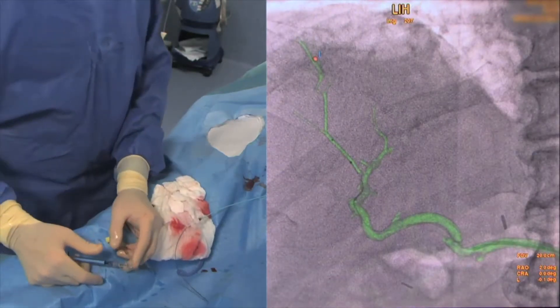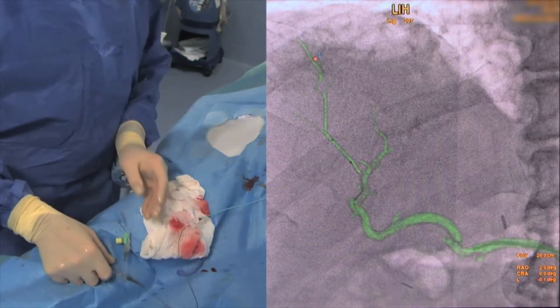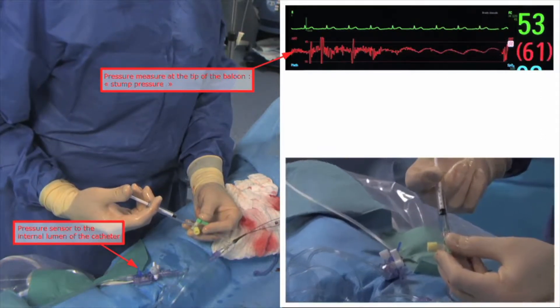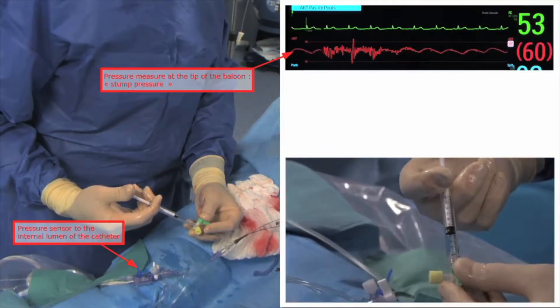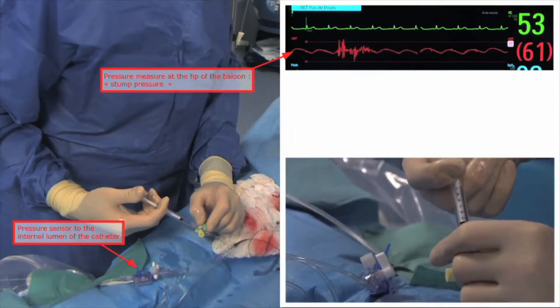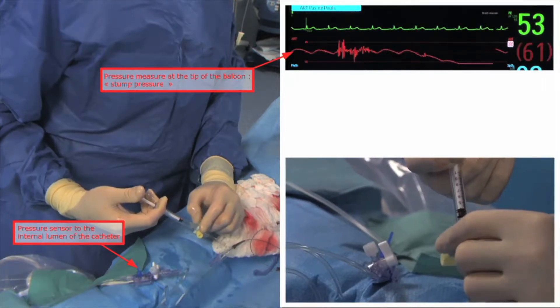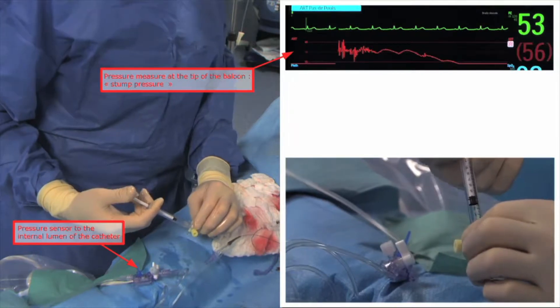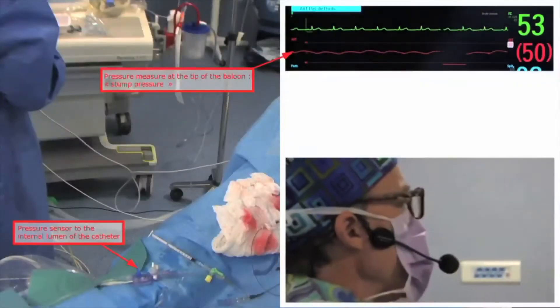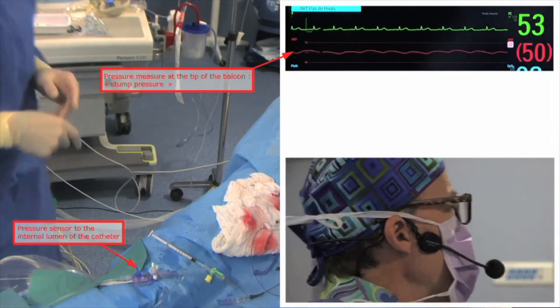I'm now ready to treat, and I will prepare my emulsions and then inflate the balloon. I will inflate the balloon with 0.1 milliliters, or maybe even less, because that's a very tiny artery. And we can see the drop of 10 millimeters of mercury after inflation.